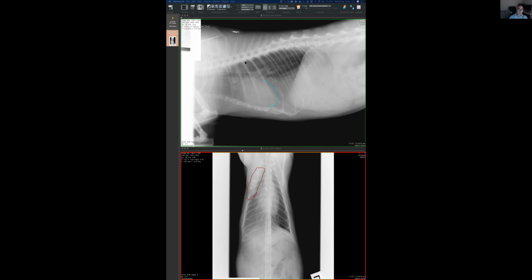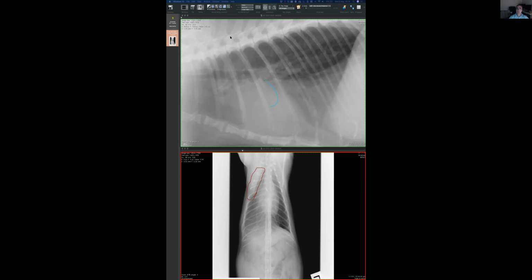Otherwise, at least put a question mark. You are going into a dangerous area, easy to make a mistake there. So at least be careful. If you can find a nodule, which is around 5 millimeters, and you find it in this peripheral lung, then I'll buy it. Then I need to say you are right. If you show me something small, let me see.